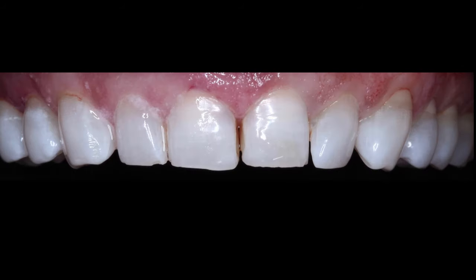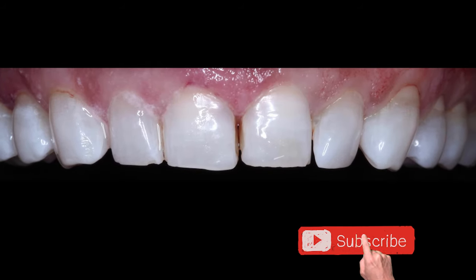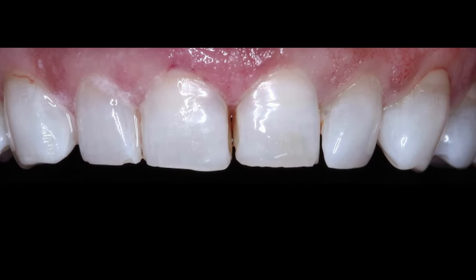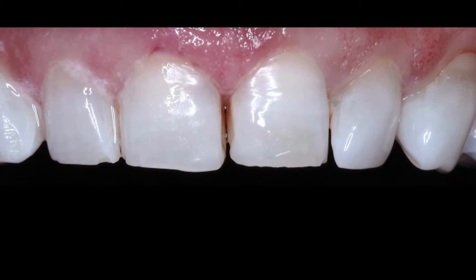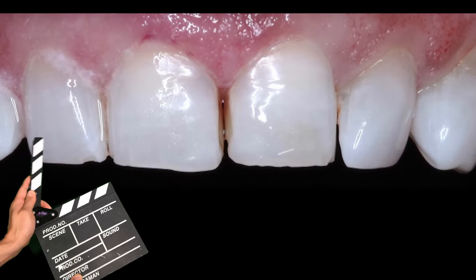A particular patient came to me requesting an improvement to her smile. She's worked in dentistry for a while. When we think about what an aesthetic smile is, it typically would be a smile that follows the lower lip line. If we factor the entire patient's face and smile, the lip line is super important — it frames the teeth behind it.